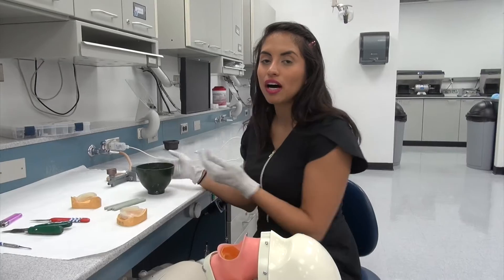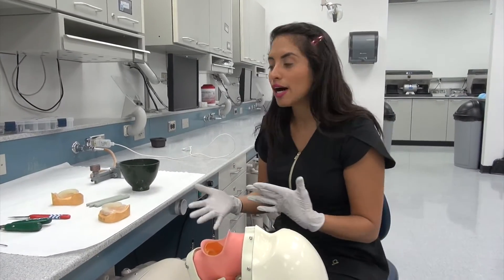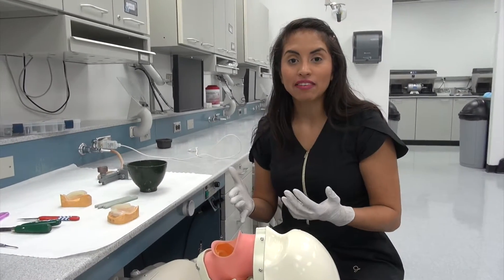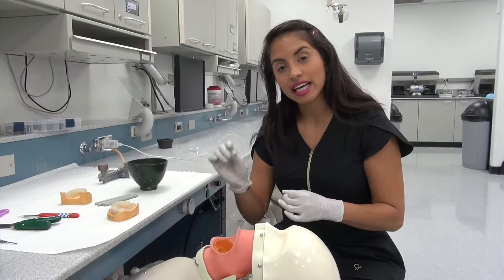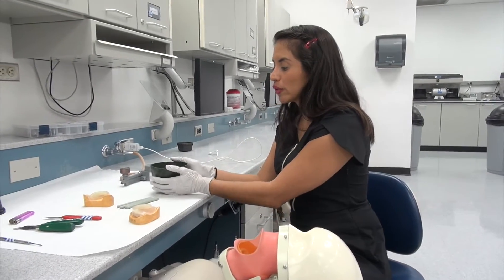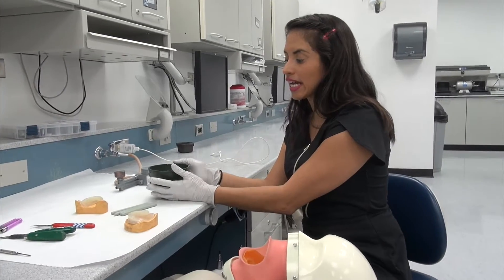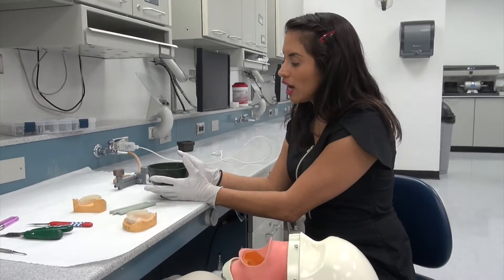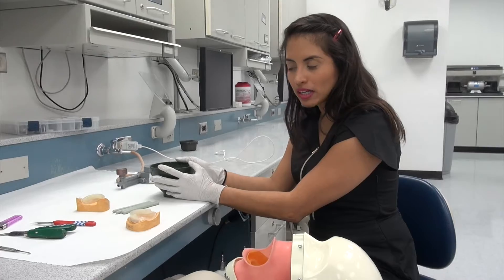Today, you're not going to have a hot water bath. When you're in clinic, you're going to have a hot water bath that you can set to 140 degrees. Here, you're just going to be using a bowl with lukewarm water.